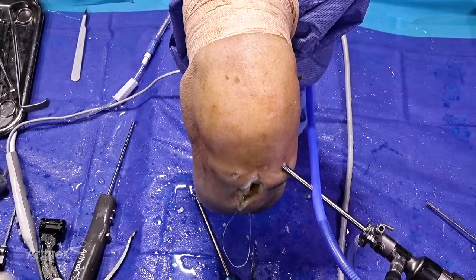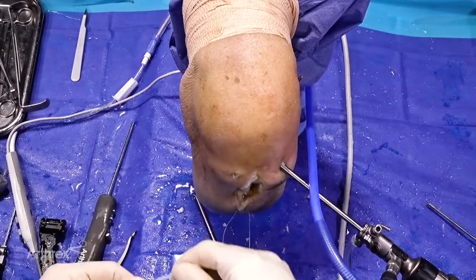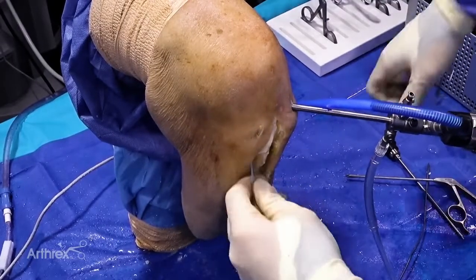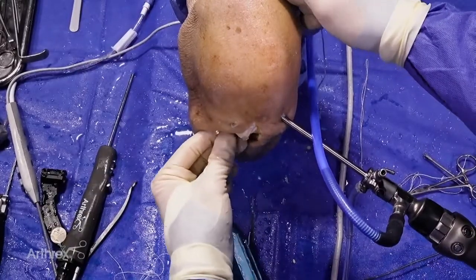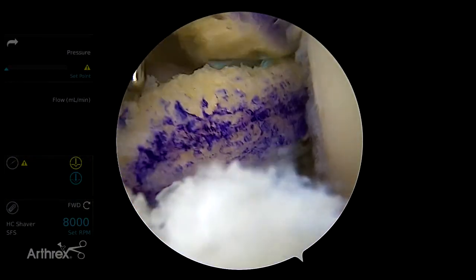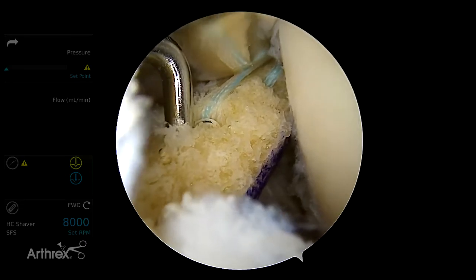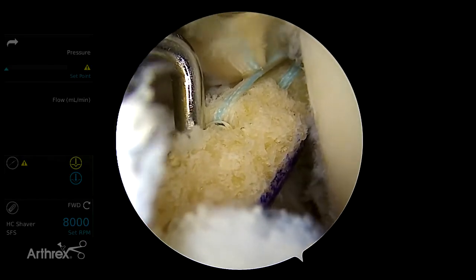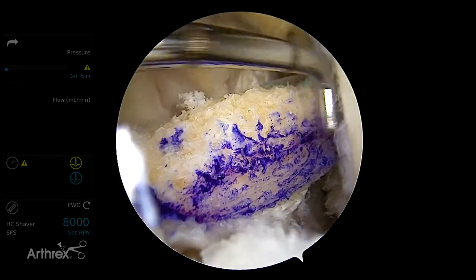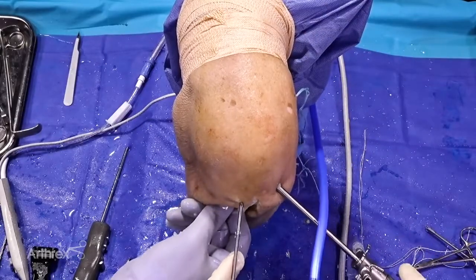With the patellar tendon prepared — triangular on the patellar side and rectangular or round on the tibial side — I use the patellar bone plug in the femur, which allows taking less bone. The passing stitches go out easily through the lateral thigh. Regarding hole positioning within the patellar tendon: one is on the vertical aspect at the apex of the triangle, the other on the far side. This minimizes the risk of suture cutting during screw and tapping placement, with sutures placed on the far side of where the tap and screw will be placed.